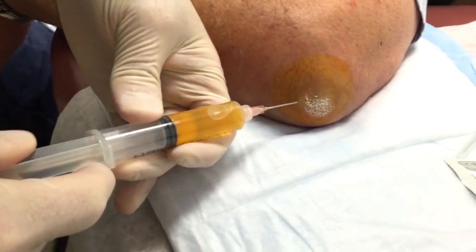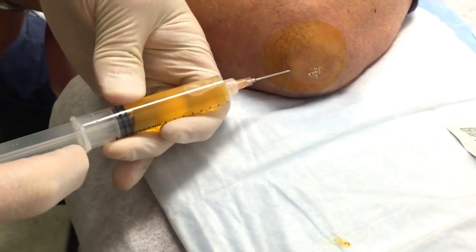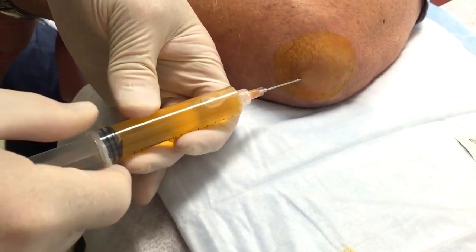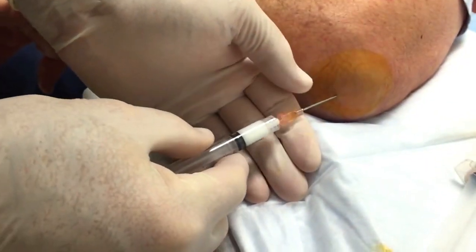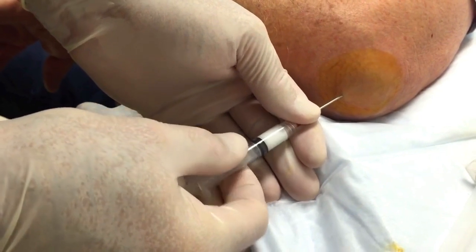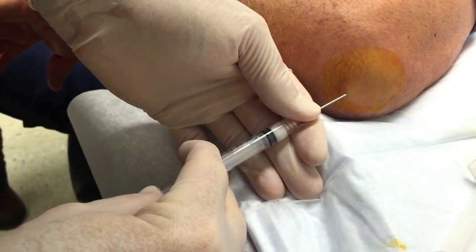Remember, this is called an olecranon bursitis. No pain, all right? We're gonna see if we can get this to come off here. We did good — I'm screaming! You take that needle off for me. We don't want you to scream.